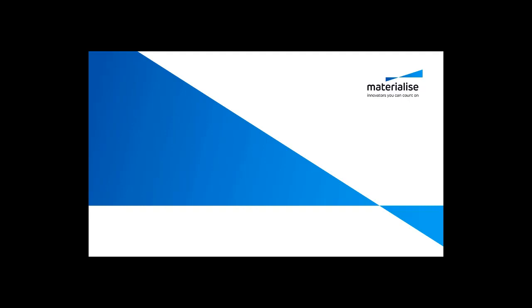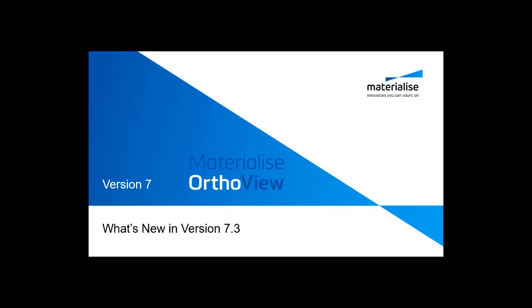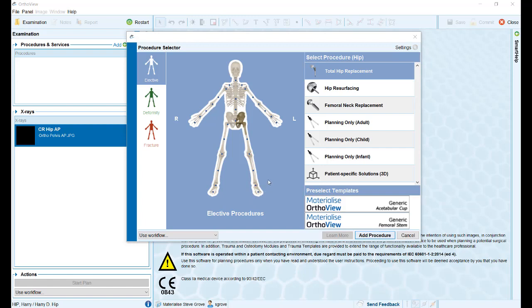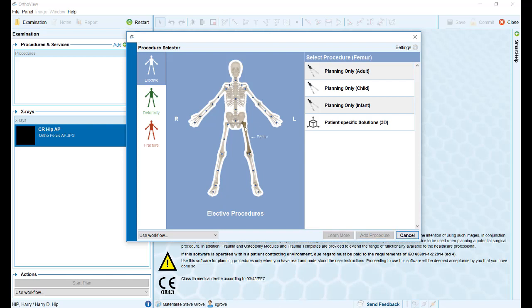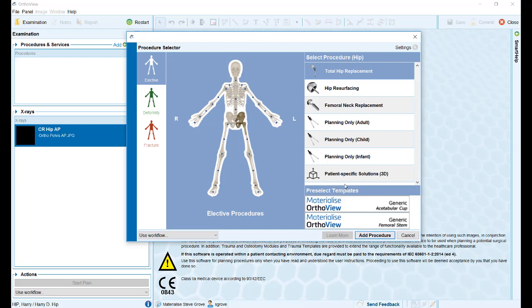Welcome to this short video outlining the major new features introduced in OrthoView version 7. We will start with the new and enhanced procedure selection panel, making it easier than ever to select your required procedure. We also have the option of linking to the Materialise websites to view some of the advanced 3D solutions available from our company.